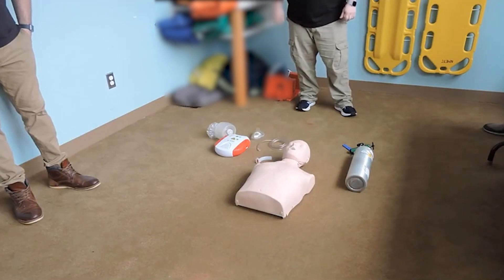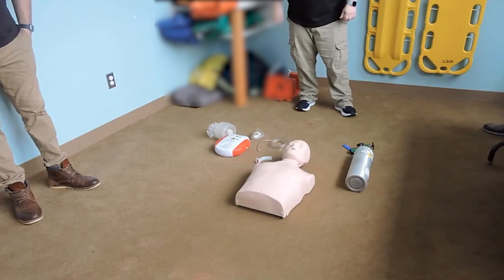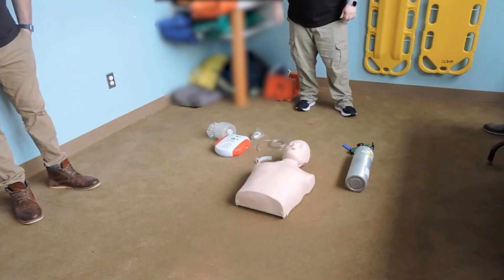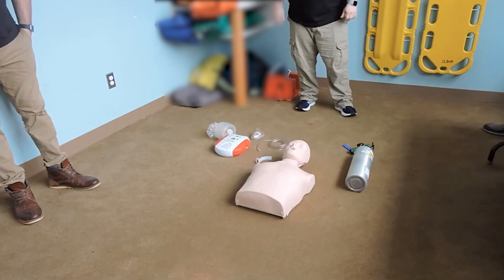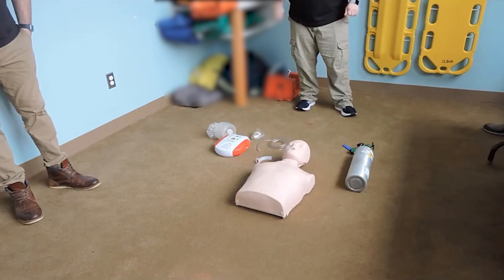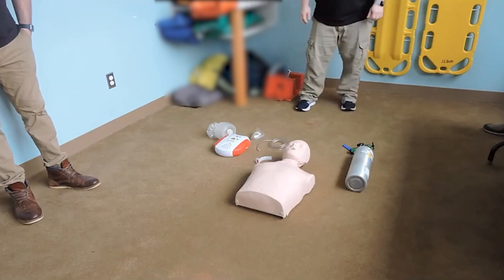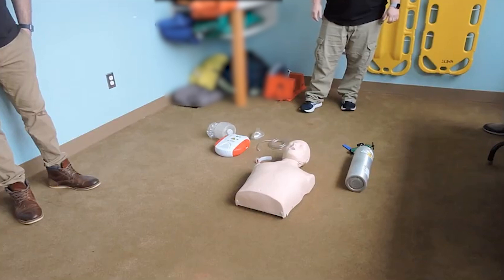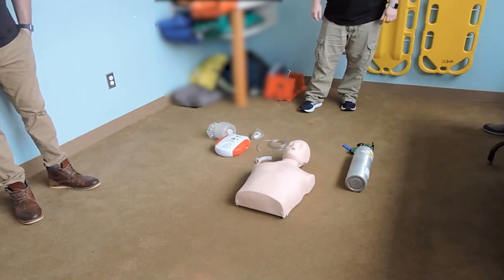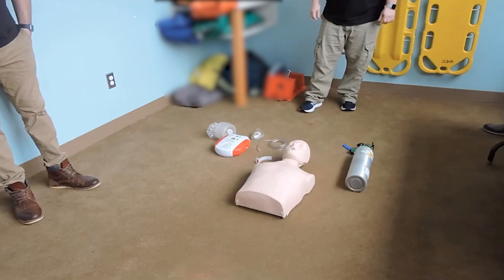You're expected to demonstrate assessment and management of cardiac arrest utilizing CPR, AED, and oxygen equipment. Before you begin, you can examine the equipment and assure yourself that it is sufficient for your purposes and working properly. Please let me know when you're ready to start. Good luck.